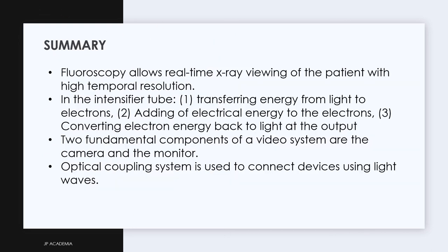Okay, summary. Fluoroscopy allows real-time X-ray viewing of the patient with high temporal resolution. In the image intensifier, we have this summary of steps: first, transferring energy from light to electrons; adding electrical energy to the electrons through acceleration; and converting electron energy back to light at the output part of our II. Two fundamental components of a video system are the camera and the monitor, and we also have the optical coupling system, used to connect devices using light waves. So that's it. Thank you.